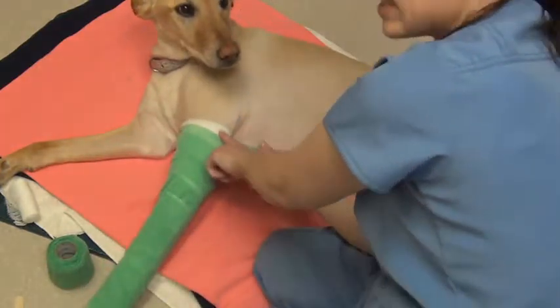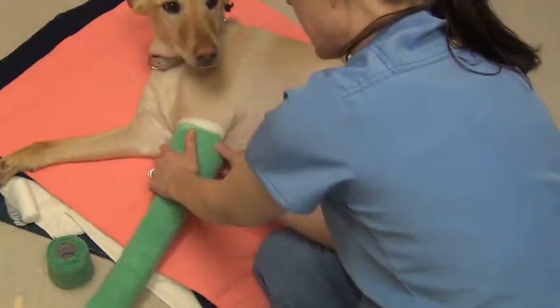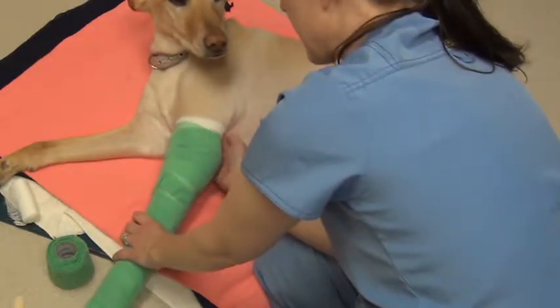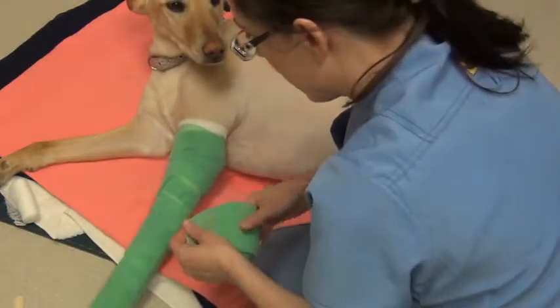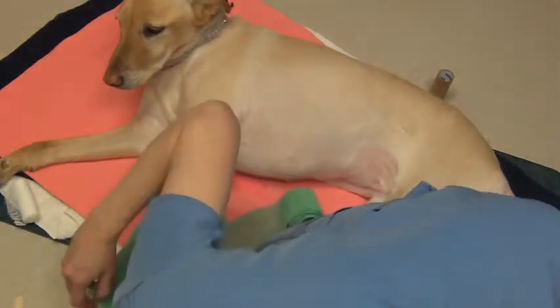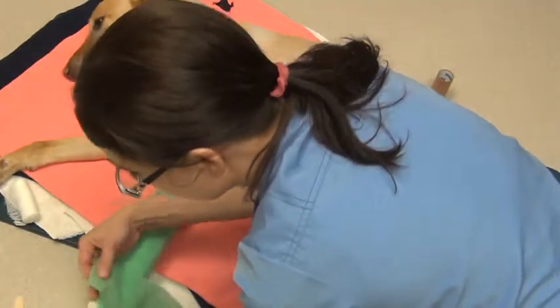I'm going to leave a little bit of that sticking out like Dr. Jody said on the video, just in case you have a splint that comes up that high. You want to make sure that you've got some protection for the axillary region. And I'm going to actually put a little bit more vet wrap up here because it looks a little bit thin. And I'm going to check the bottom to make sure the middle portion of my splint's not hanging out. So I'm just going to apply one more layer.